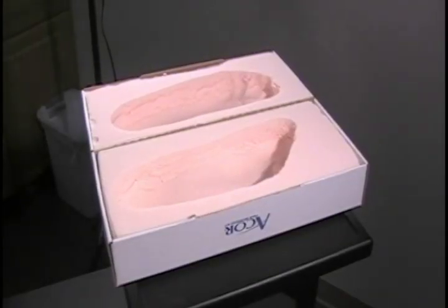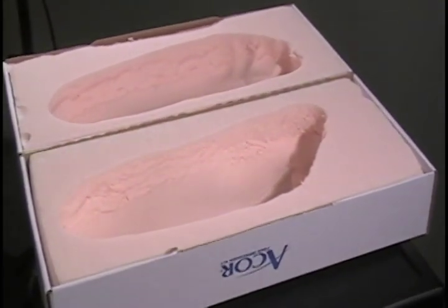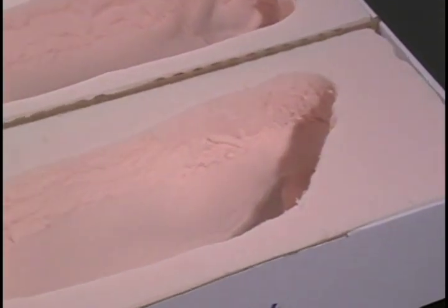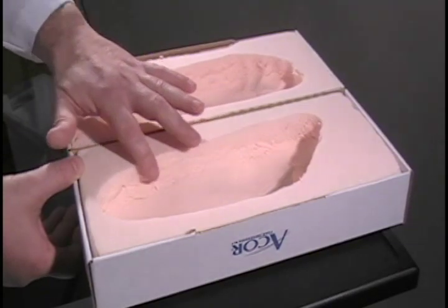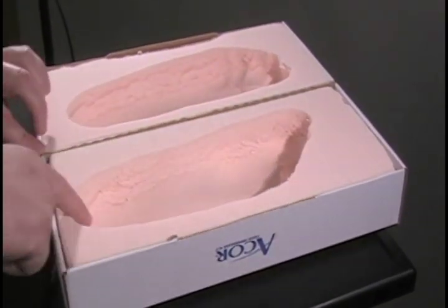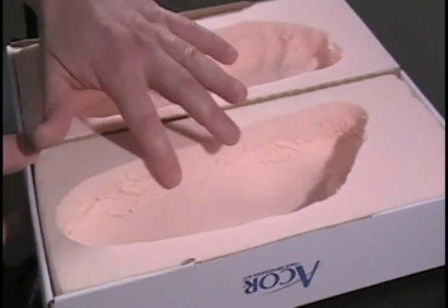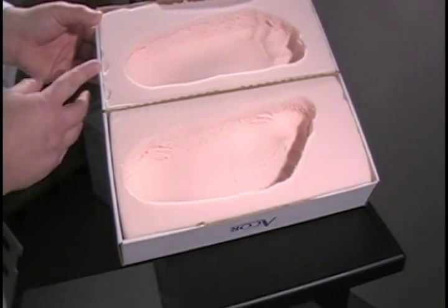In this segment, I will be going over how to prepare the foam impression for the 3D Pedia System. After you have taken the cast, the foam will need to be prepared by smoothing the toes, the heel, and both the medial and lateral side. All you need to do is take your finger and just nicely rub it and smooth this region out. Once you're done, it should look like that. You'll need to do this for both the left and right foot.